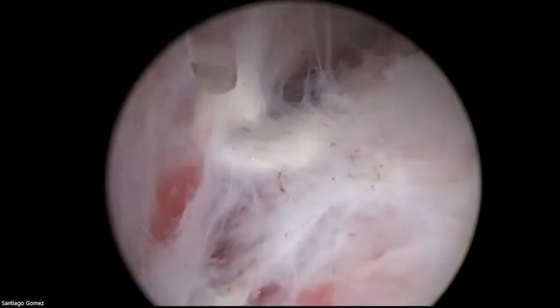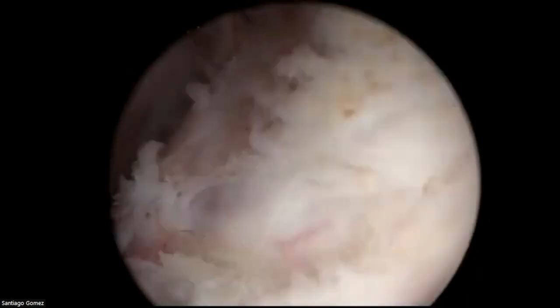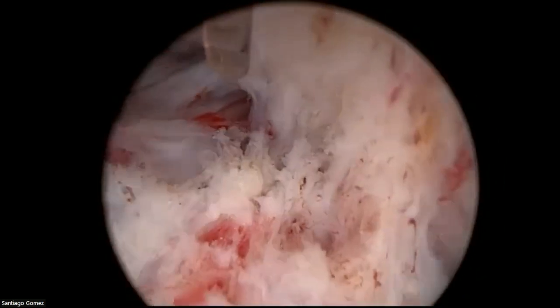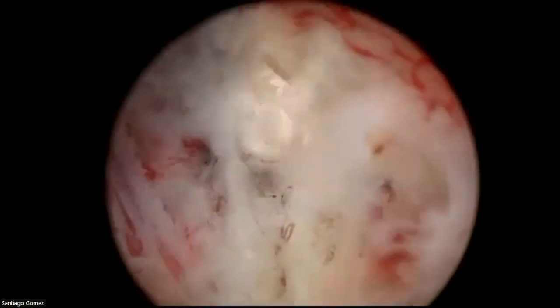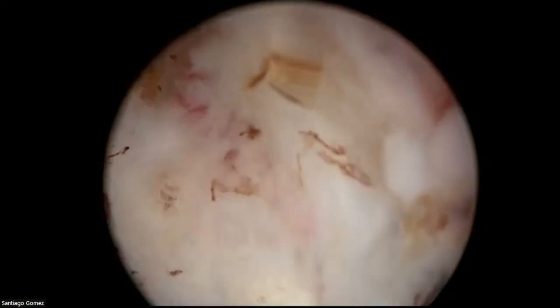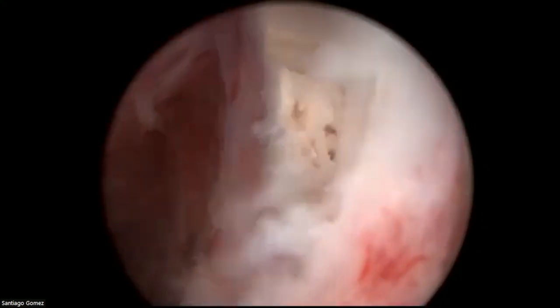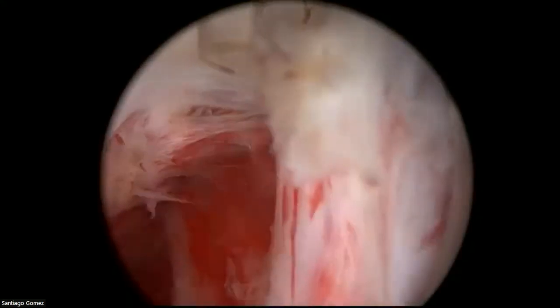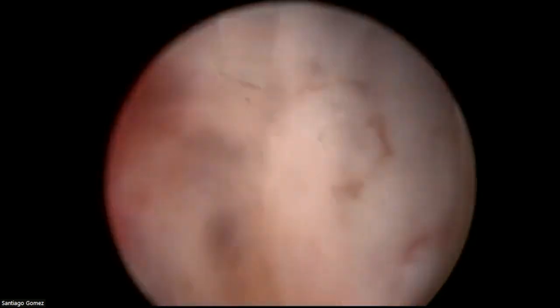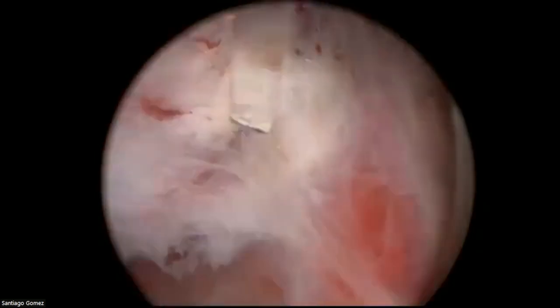So you see here, I'm mobilizing the lateral aspect and also a little bit the anterior aspect, because when we go to cut the 12 o'clock fibers later, we will have a very nice idea of where things are going. Let's go to the other side. I will deepen the incision again. This is like in the Freyer operation, you need to go slightly deeper until you get more exposure. Of course, I do it in the white line. I don't mind cutting a little bit on the adenoma because here I'm going to look for the lateral plane. Initially, the first dissection is going to be only 4 or 5 millimeters like this, because we will enter in the lateral plane.